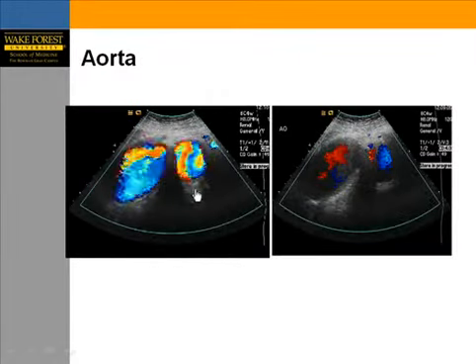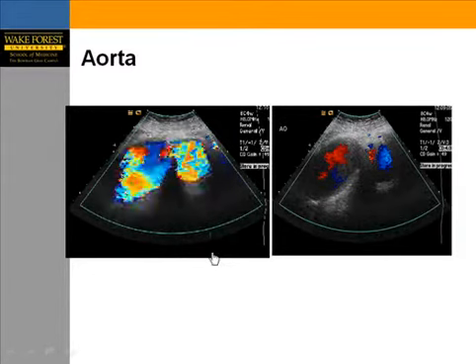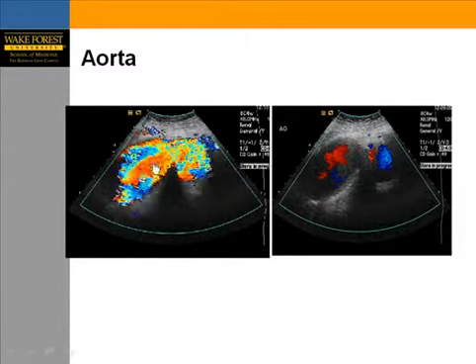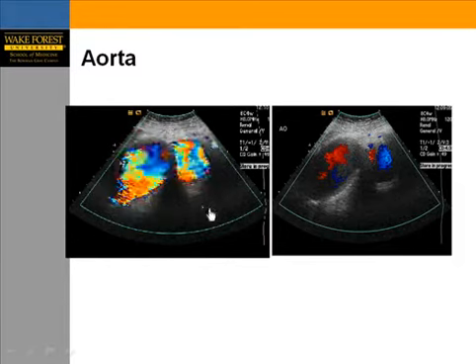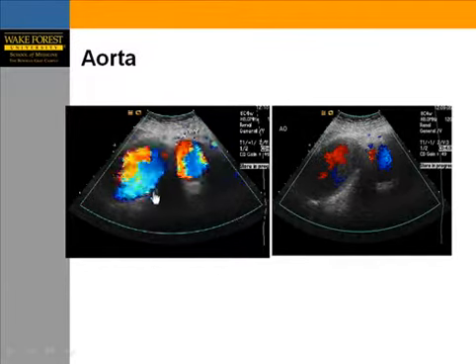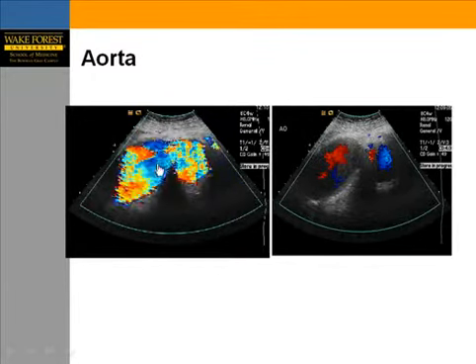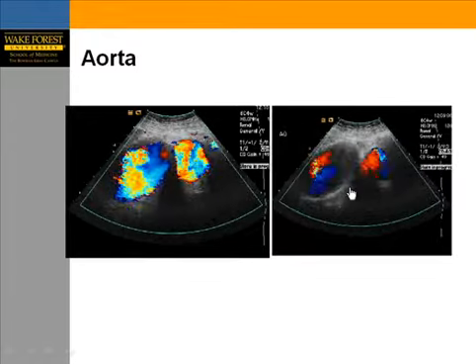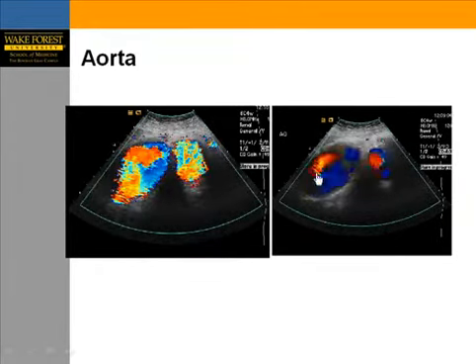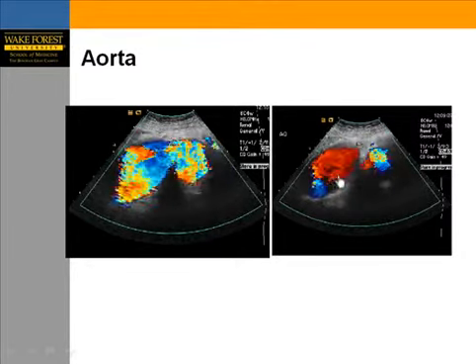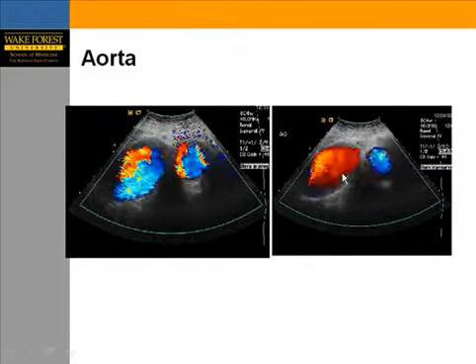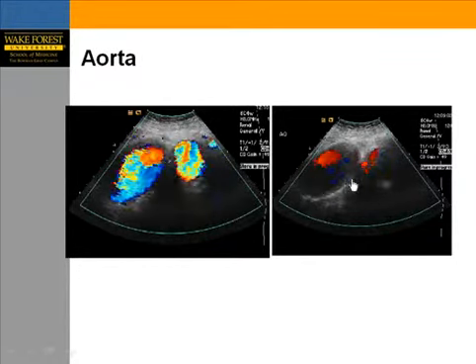This is an important hint: whenever you evaluate the aorta, make sure you have the right settings for scale and frequency. In this instance, there is a lot of aliasing in this aorta — there is an aneurysmal dilatation, but if there is a dissection, you could easily miss it. Adjusting the scale confines your color signal to the lumen, eliminates aliasing, and allows you to identify any abnormality in flow or two lumens with ease.